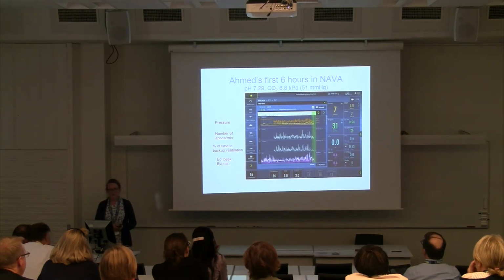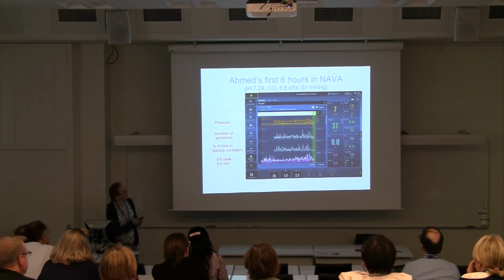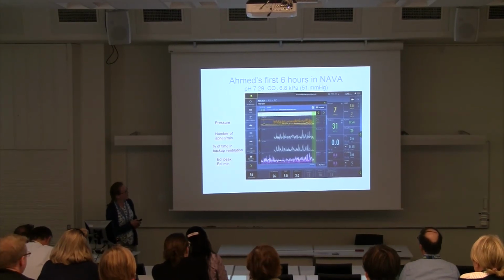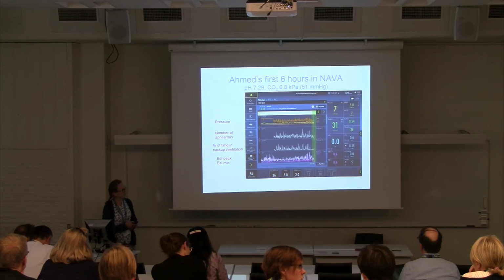This is Ahmed's first 6 hours in NAVA ventilation. The same was seen in pressure. This is his peak pressure, and a significant decrease after the switch to NAVA. The number of apneas per minute, the value is from 0 to 12, and the percentage of time on backup ventilation, and his EDI peak and minimum values.